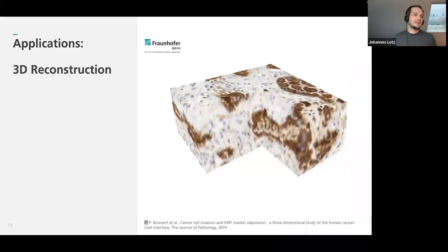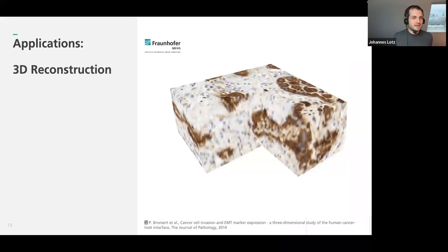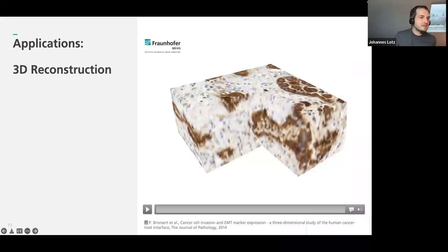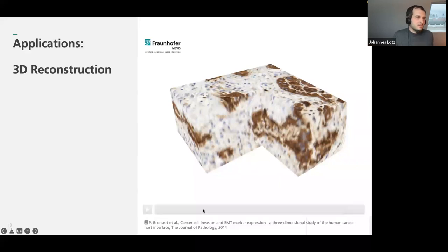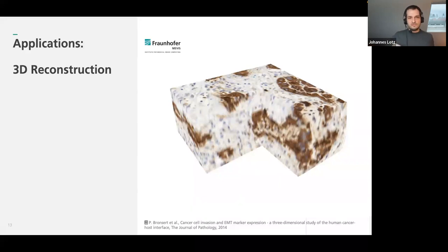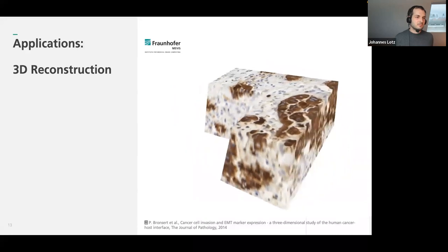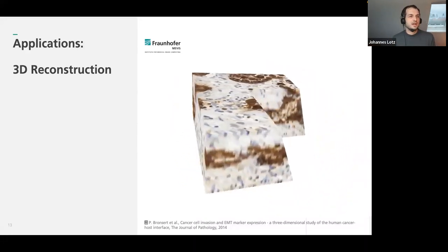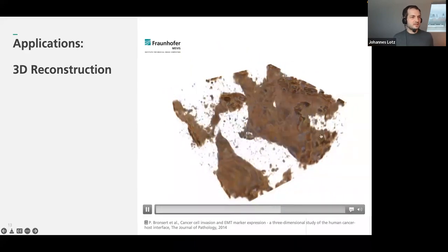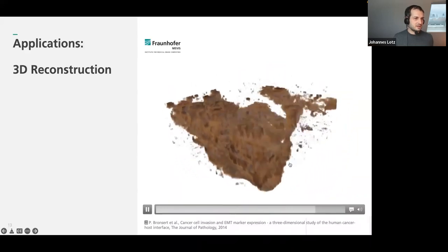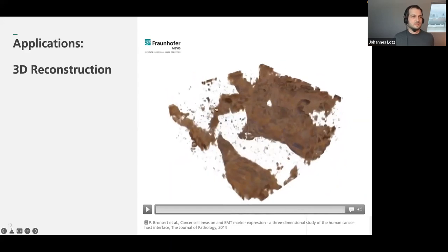A third application — not for clinical routine but useful in research — concerns tumor budding. We worked with a clinician in Lübeck on the question: are these cells here connected to the larger block of tumor cells in another region? This is difficult to say in 2D, but what we can do is rebuild the 3D structure from a series of tissue sections by registering all of them together and reconstructing the tissue block. In 3D, you can then segment or threshold the tumor mass and see all the connections between different tissue compartments.